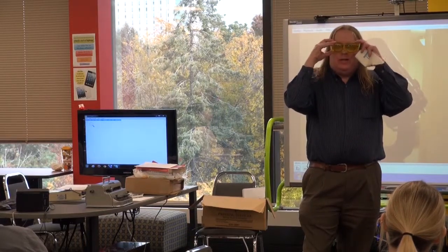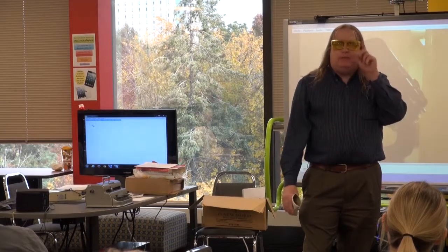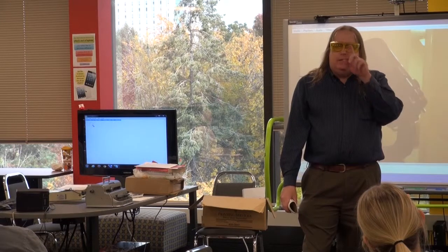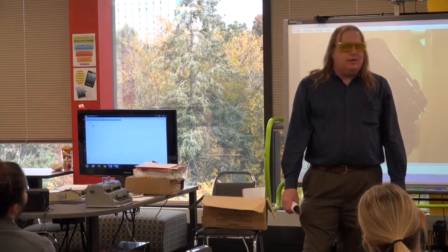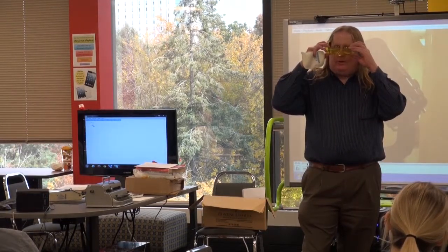So one of the ways that I can improve the sharpness of vision is by giving me these yellow-green glasses that only let one color through. So it makes the world, yes, I know, look only one color, but it's very sharp because all those rays of light are focused at the same point inside of the eye. So if I ever need to sharpen up my eyesight, this is one way to do it.